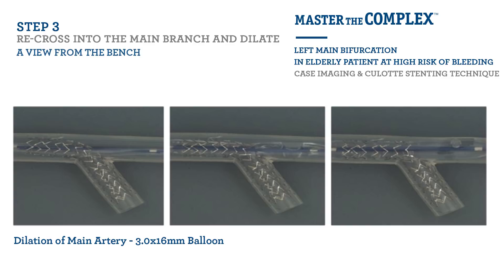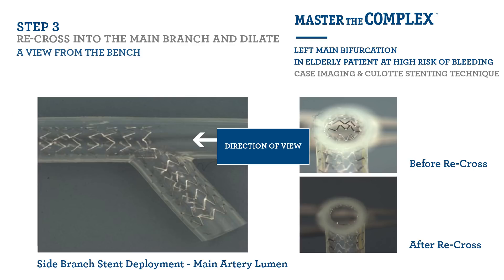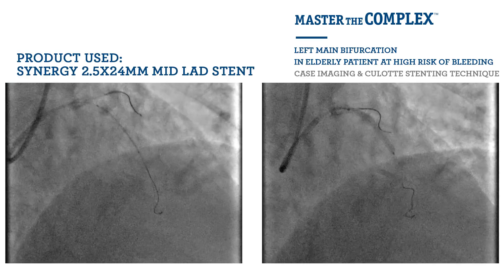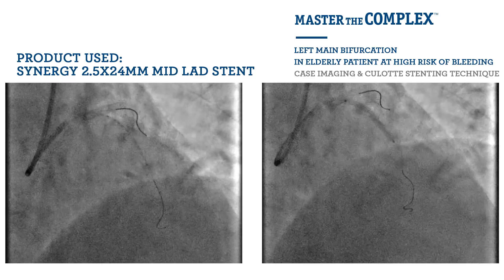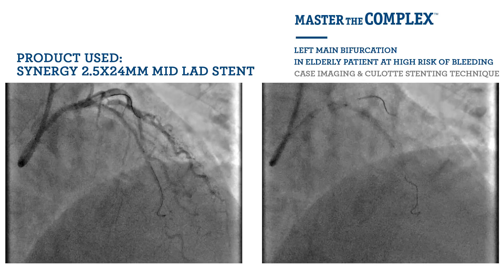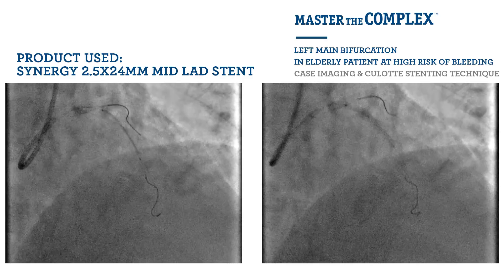You can see how large a hole the balloon makes in the sidewall of the stent. In the top right-hand image, the view down the LAD towards the left main stem shows the crowns of the Synergy stent and the connector in the middle of the view. Following recrossing and dilation of the sidewall of the stent, you can see exactly how large a hole has been created to allow stent passage. We then deployed a Synergy 2.5x24 mm stent within the mid-LAD, extending back towards the first diagonal branch.